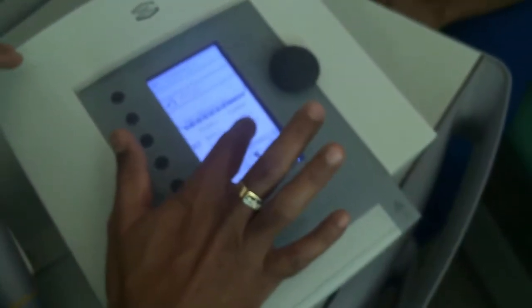It's programmed. Yes. Once you set the dosage, time will become automatically set. No need to put any time here. It is automatically set in manual operation also. How much time? The time is 1 minute 16 seconds. So for 1 joule per centimeter square, we have to give 1 minute and 16 seconds. Automatically it finishes. Okay. Now it is in lead 1.